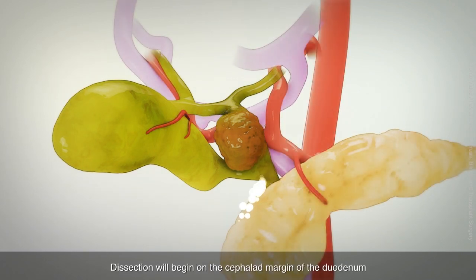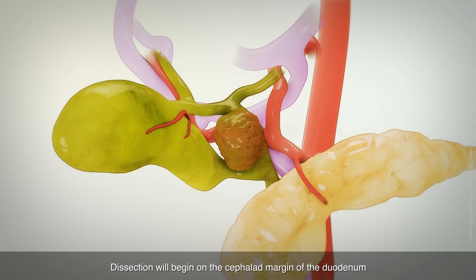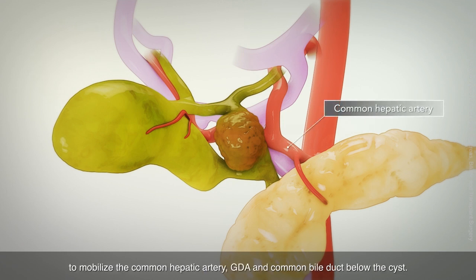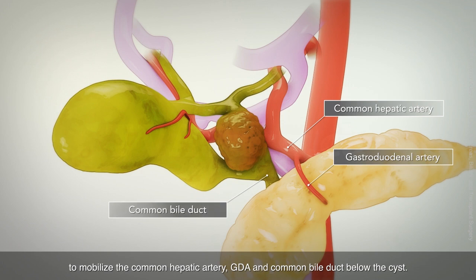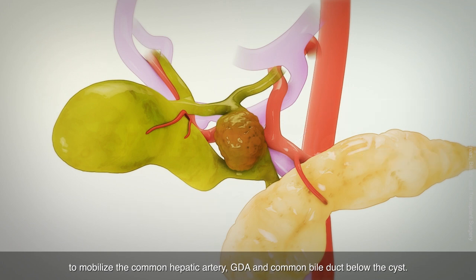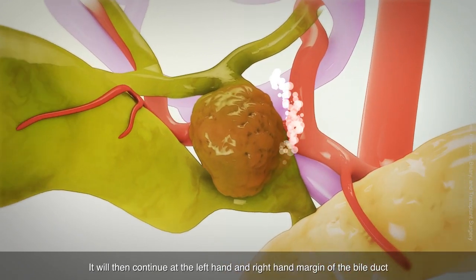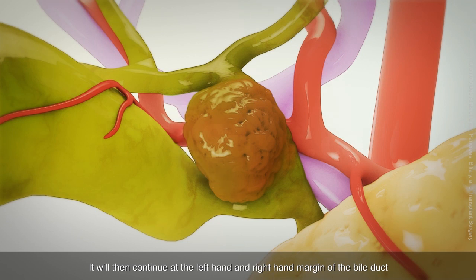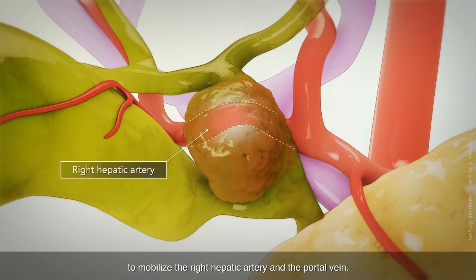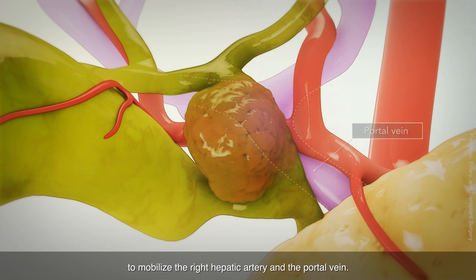Dissection will begin on the cephalad margin of the duodenum to mobilize the common hepatic artery, GDA, and common bile duct below the cyst. It will then continue at the left-hand and right-hand margin of the bile duct to mobilize the right hepatic artery and the portal vein.